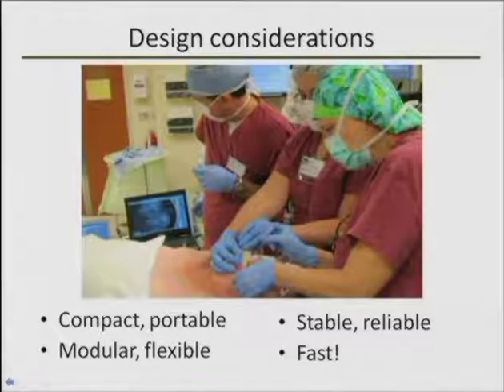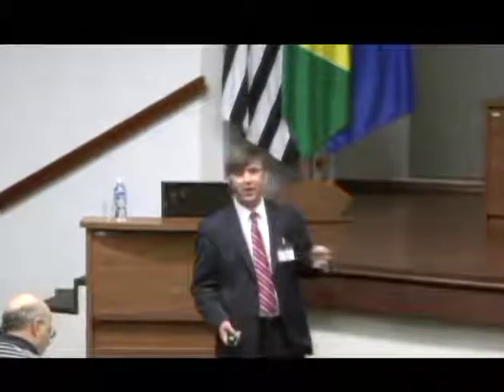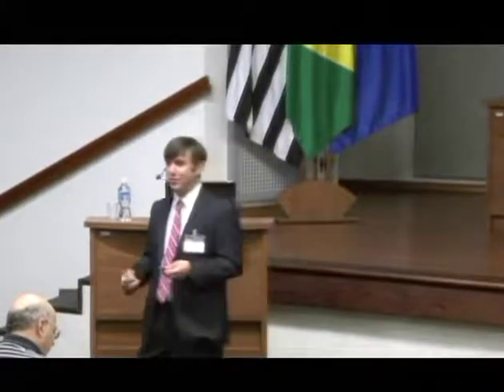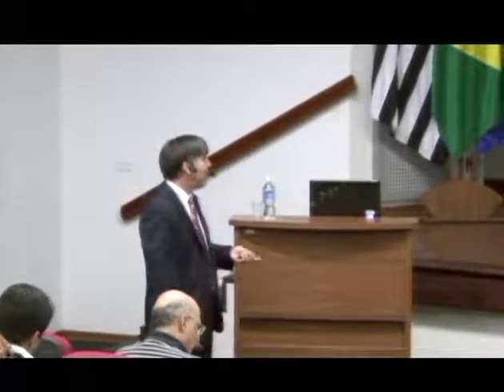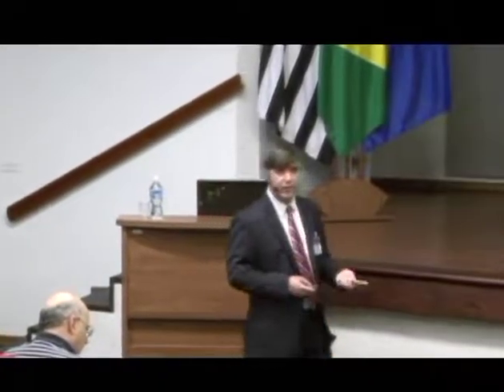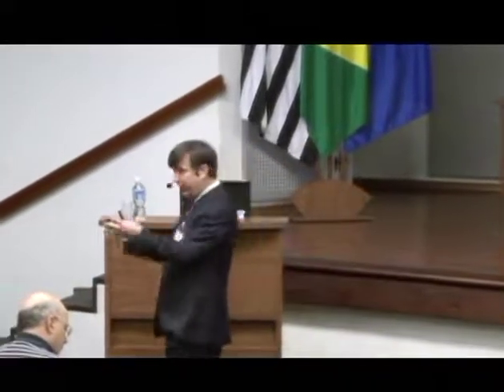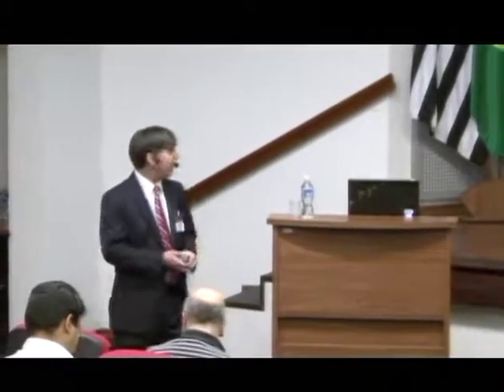Also keep in mind that these instruments are typically used on many different protocols at many different clinical sites for quite a few different purposes, often multiple times in the same day, and so we end up having to carry these things all over the medical center in Houston to different clinical locations. So they have to be compact and portable, but they also have to have a high degree of modularity and flexibility so that we can mix and match different modalities. We can say for this patient we want to do this type of measurement, for this patient it's more appropriate to do this. If the clinician wants to try a different excitation wavelength, we can easily switch things out.